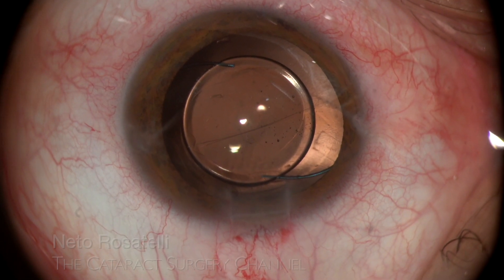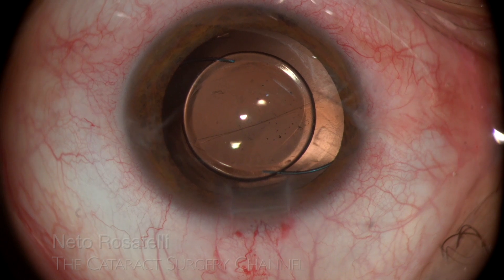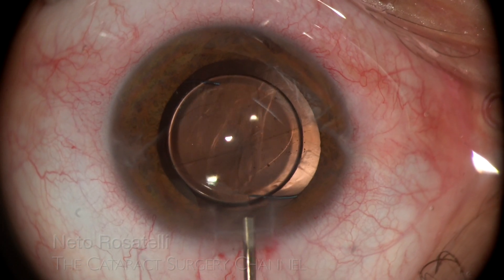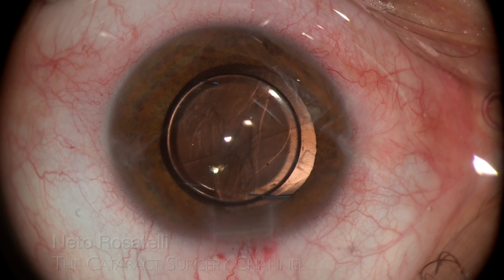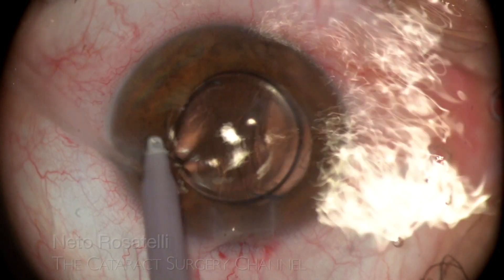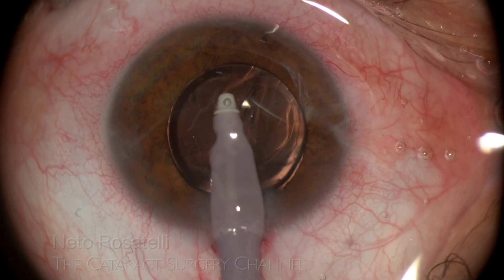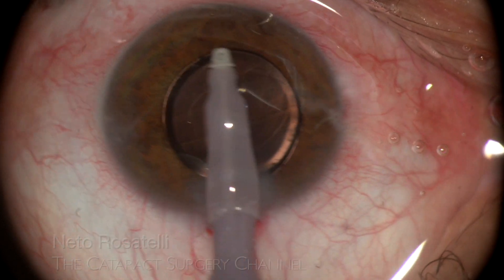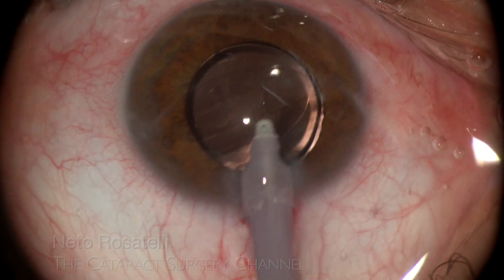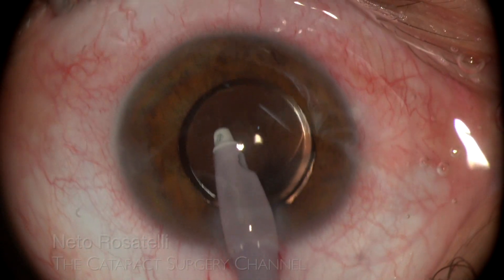Ovalization of the rexis margin after IOL implantation confirms some zonular compromise. Carbachol 0.01% is injected despite the complete capsule overlap, to ensure iris coverage holding the bag down in case of anterior chamber shallowing. OVD aspiration follows, and again maneuvers must be carefully done to prevent zonular dialysis.